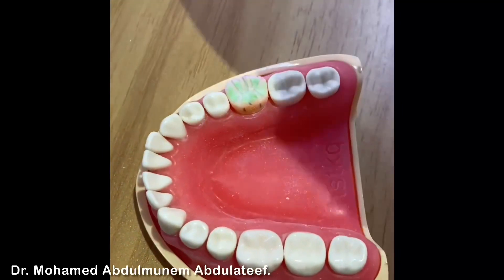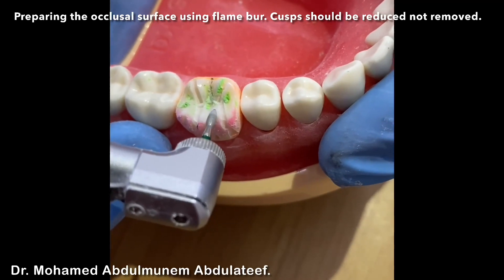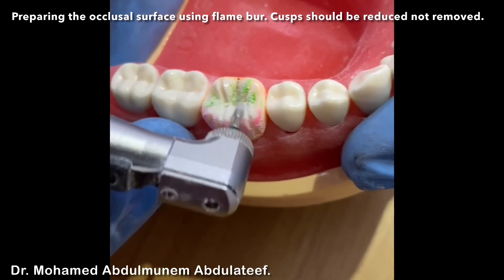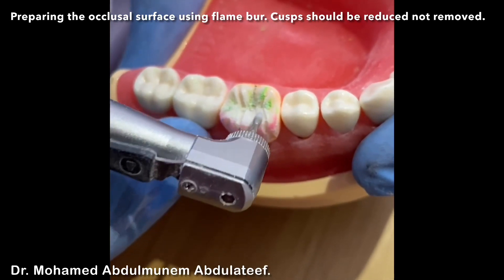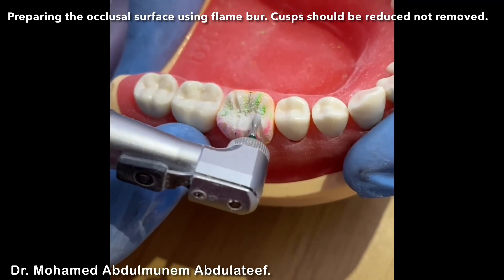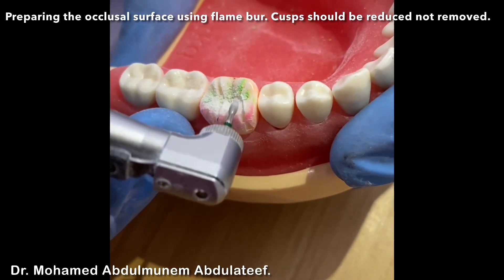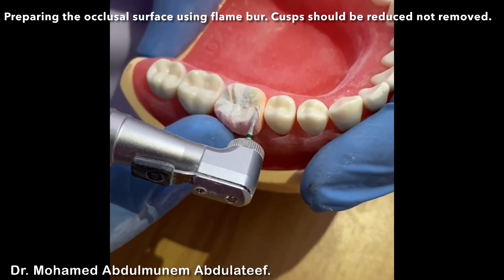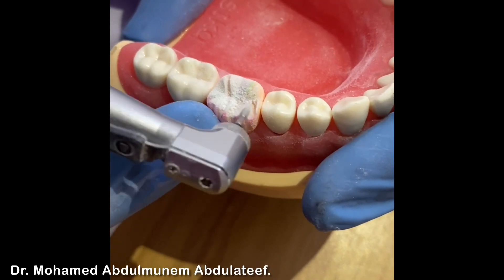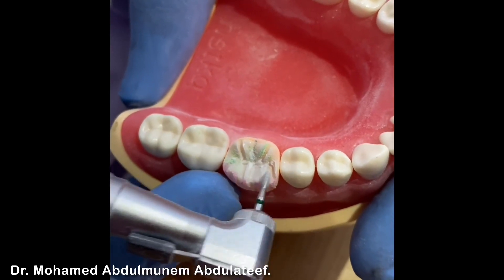Now I connect between them using a flame bur for the occlusal surface. Now I do the same with the other side — the same reduction will be completed. The occlusal surface is divided into two planes so far.